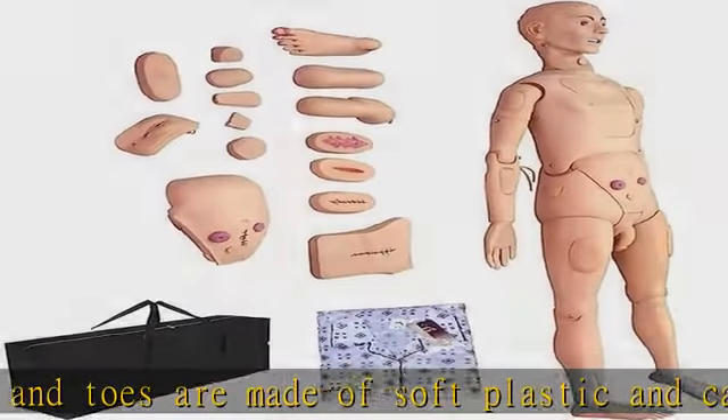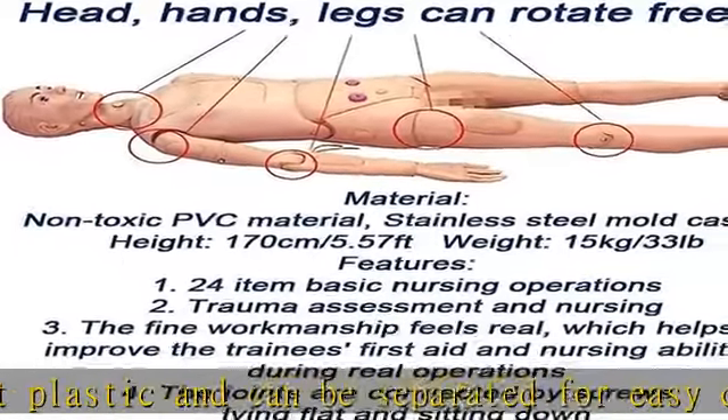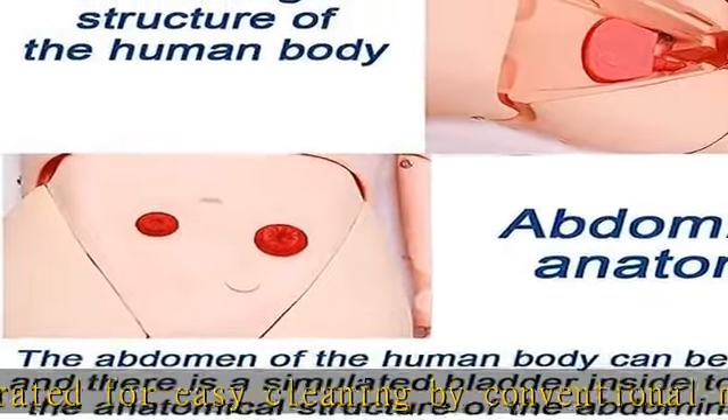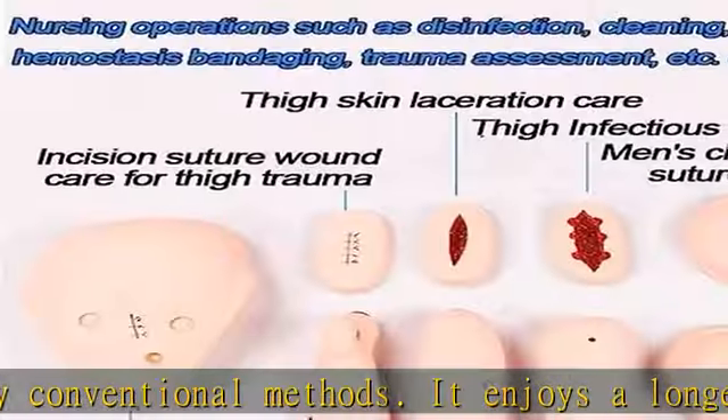The thoracic cavity and abdominal cavity can be opened, and the simulated lungs, stomach, bladder, and other internal organs can be observed. The standard anatomy structure facilitates learning nursing training education.